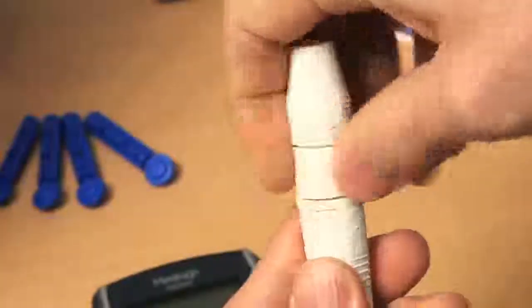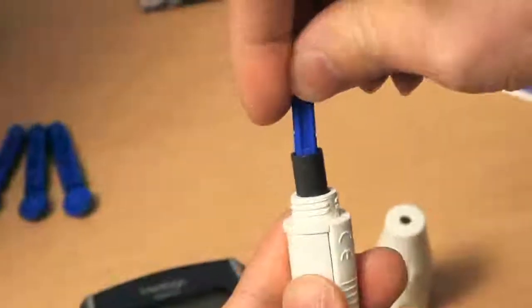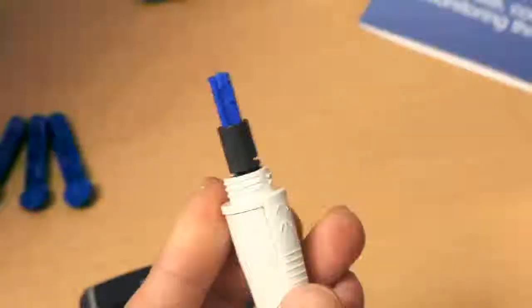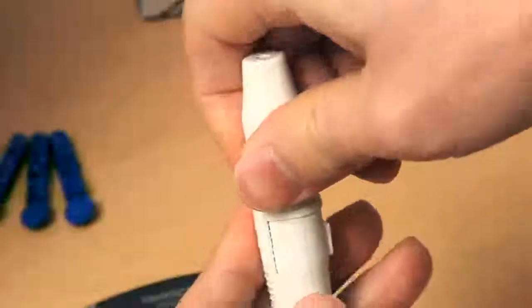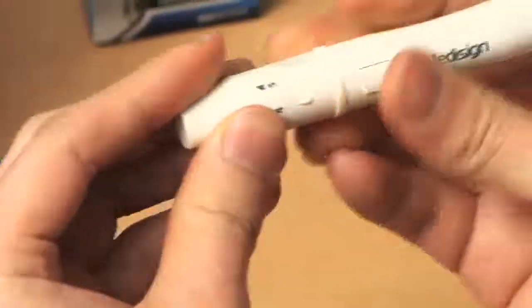These are the preparation steps for blood testing. First, unscrew the tip of the lancing device. Insert a new sterile lancet into the bottom of the lancet carrier. Twist off the cap of the lancet. Adjust the piercing depth of the lancing device.